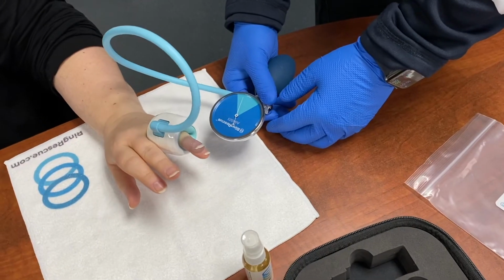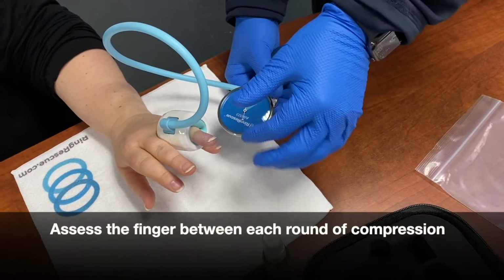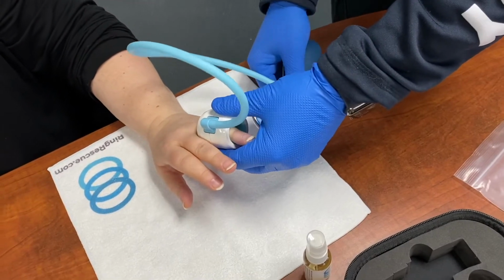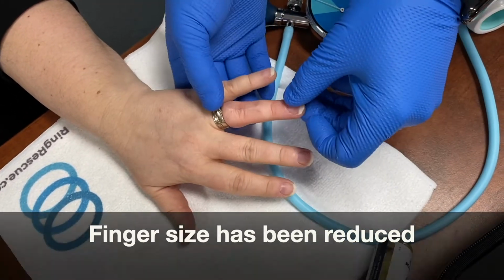We're going to take the compression device off. We're just going to take a look, reassess the finger, and see how much it's shrunken down, and then we'll probably put the cuff back on for 5 minutes, given this has been stuck for a long time, okay? So I'm just going to open the valve to let the pressure off. Wow, you can see how much it's shrunk down. You can see the seam there. So the size has come down a lot, which is awesome.